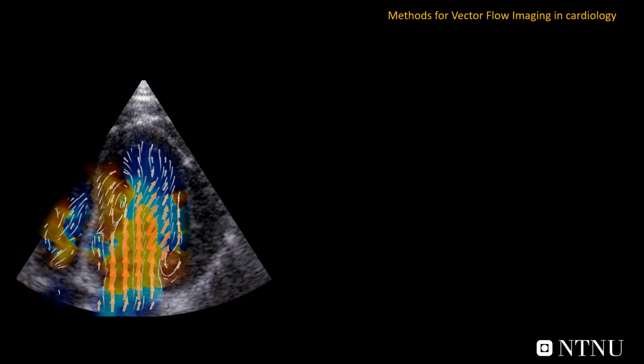Looking closer at vector flow imaging in cardiology, there are different approaches to extract vector fields. Echo-PIV tracks speckle patterns from ultrasound contrast agents to resolve the vector velocity field. By injecting contrast agents, you boost the signal from the blood. Using contrast agents is, however, not preferred in all examinations, especially in children.